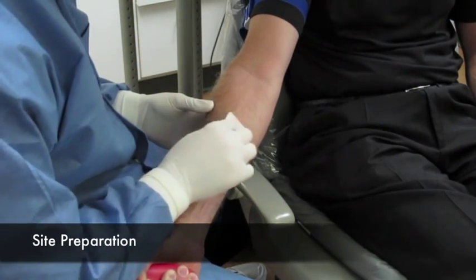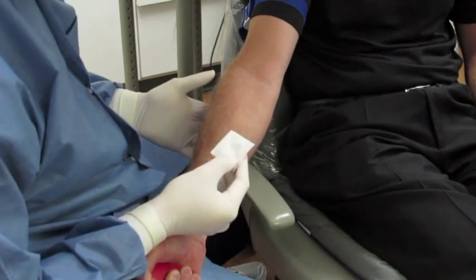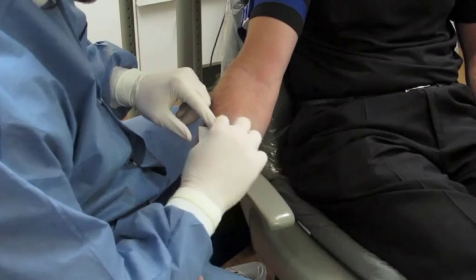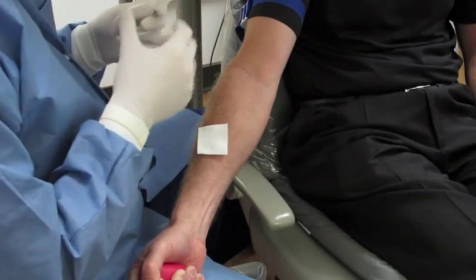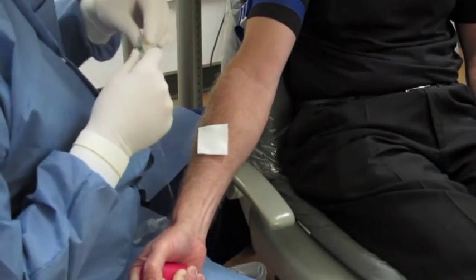Take your alcohol gauze and use a circular motion to swab around the area, being careful not to contaminate, and check for soiling to make sure it's nice and clean. One technique is to place the corner of the gauze in the area where you plan to insert your needle so you can remember where it is and not miss.